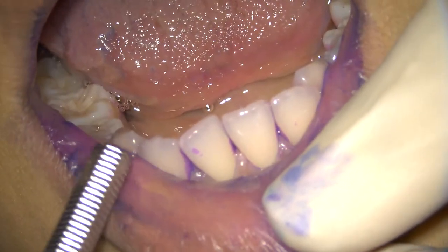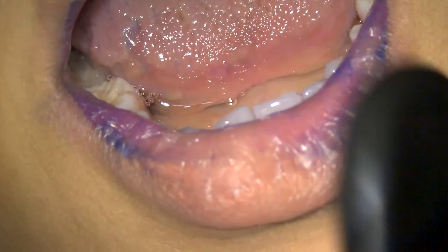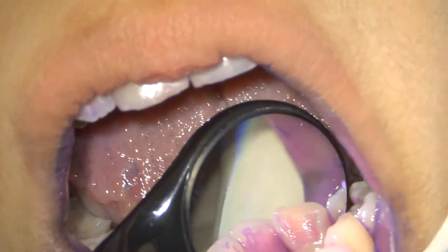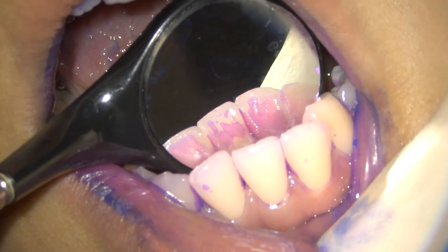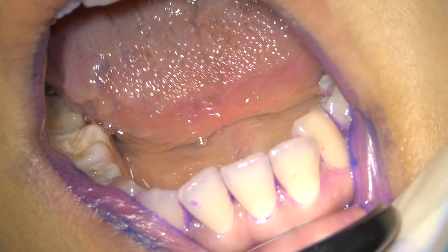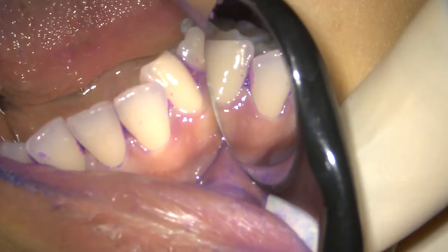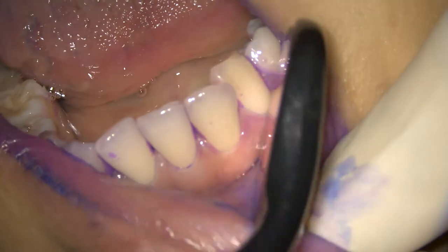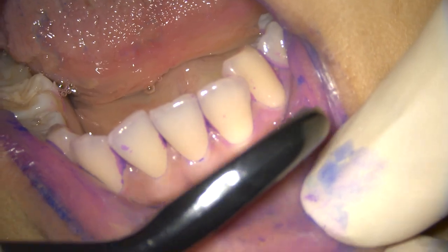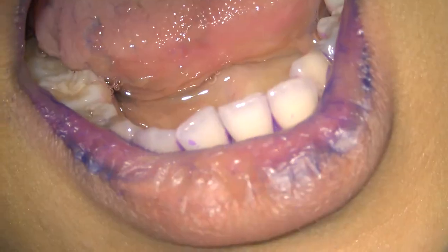Similarly you need to quickly score on all the teeth and then enter in your tabular data form. Then you can compile the percentage of plaque score. We can run one more scoring on the upper or the lower teeth. For tooth 2-3-2: lingual — obvious, score is 1; mesial — score is also 1; buccal — score is 0; distal — score is 1. Please make use of the mouth mirror properly to differentiate the proximal plaque. Sometimes there could be food deposits lodged in between the interdental spaces. So this is the way how you actually record the O'Leary plaque scoring.